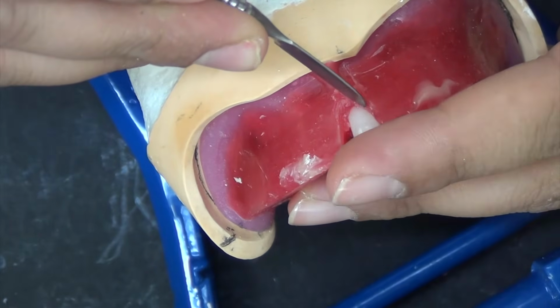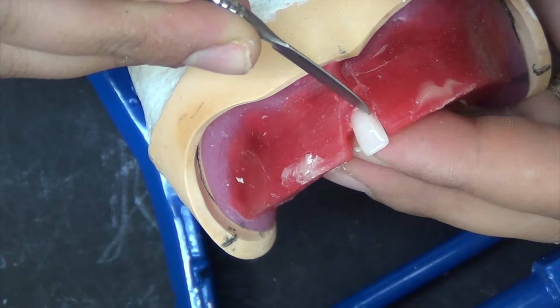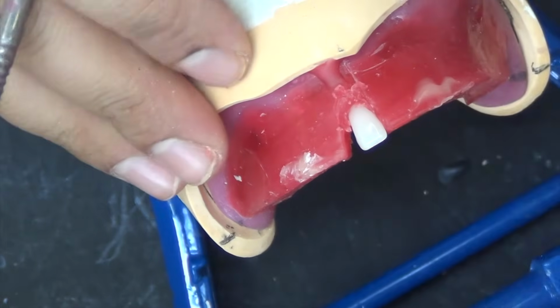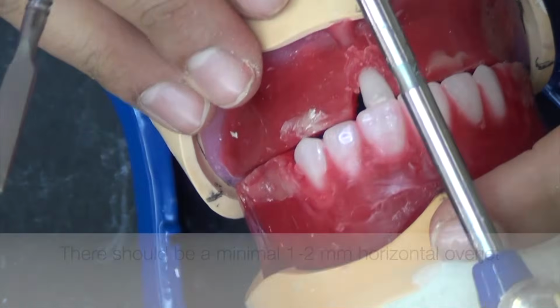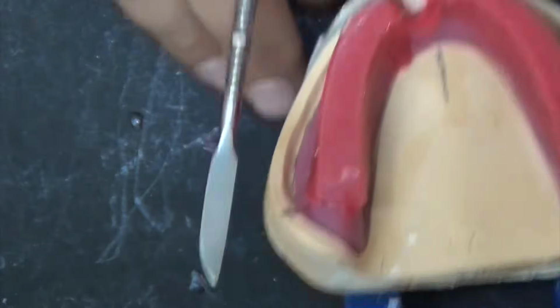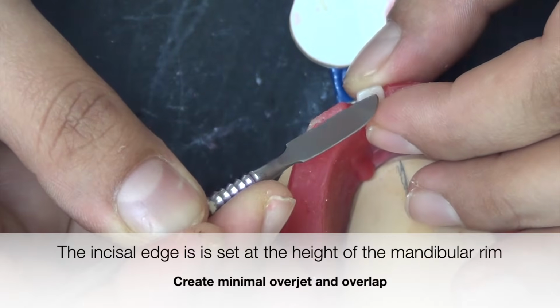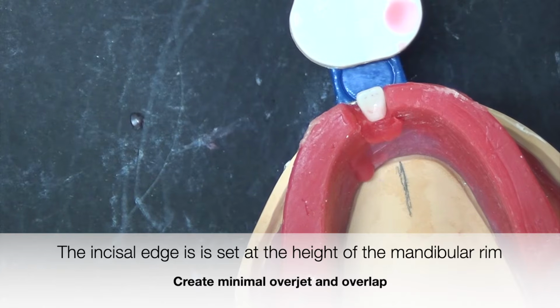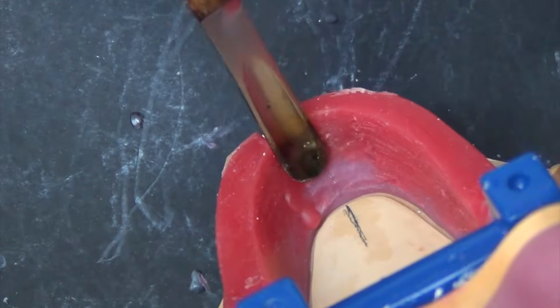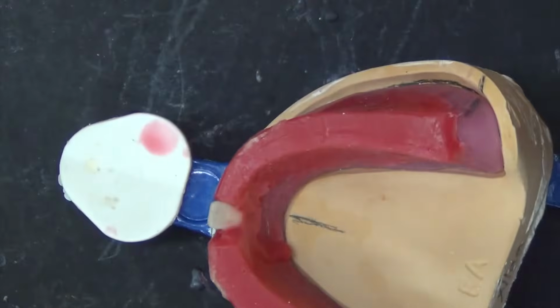Be certain that the neck of the tooth is depressed so that it is in form of the labial surface of the lower wax rim. Create a minimum of 1 to 2 mm horizontal overjet. The incisal edge is set at the height of the mandibular occlusion rim, and there should be a very minimal vertical overlap between upper and lower anterior teeth.